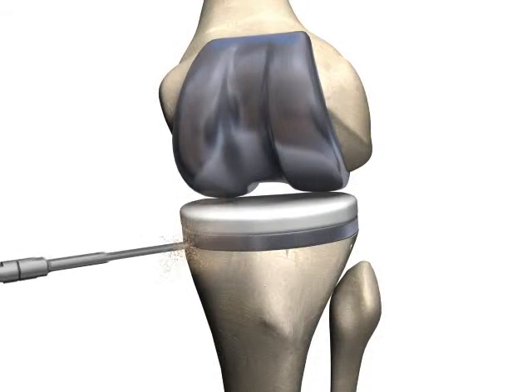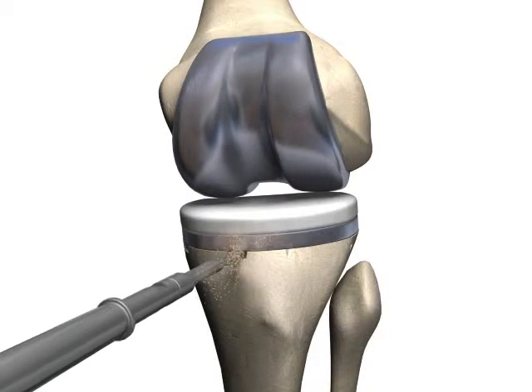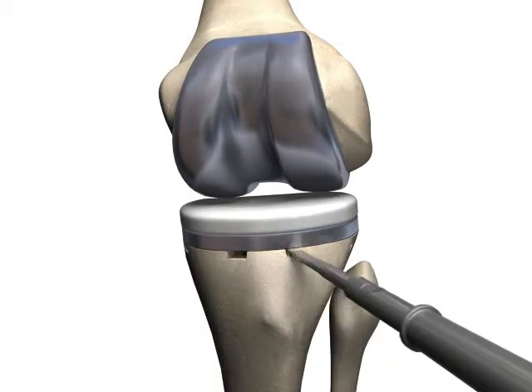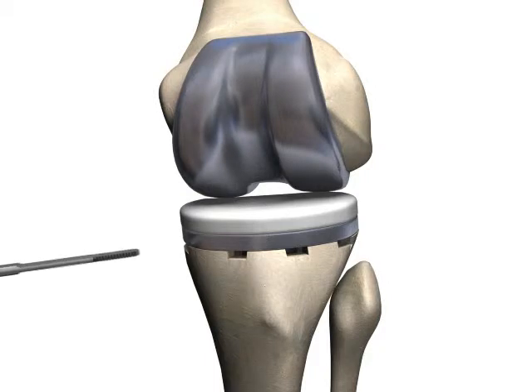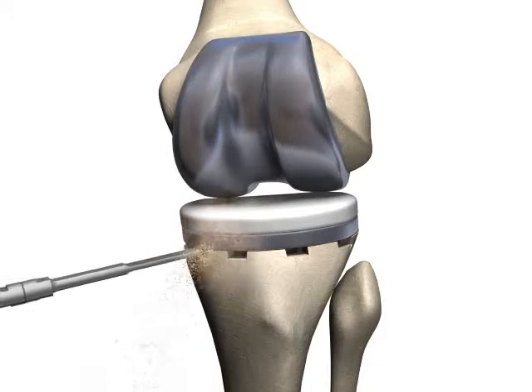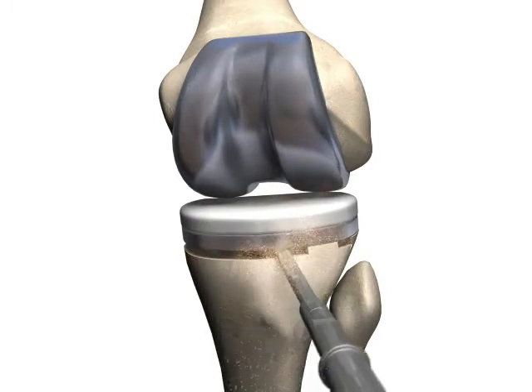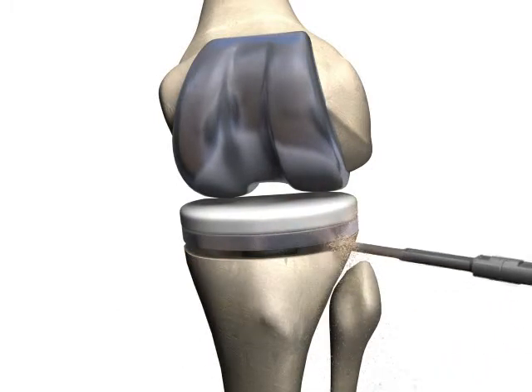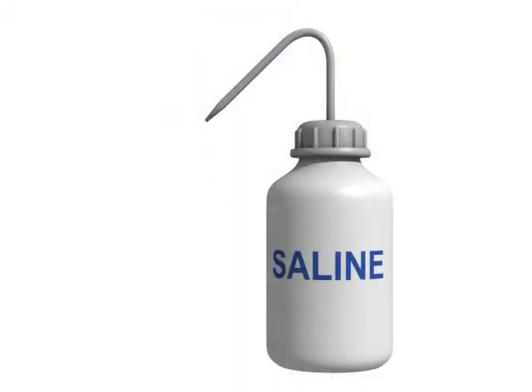The 6mm flat osteotome probe is used to penetrate the interface and create slots under the prosthesis. The 6mm serrated probe can then be used laterally to break the remaining bond between bone and prosthesis. A high-pitched noise will be heard when the active probe is in contact with the implant. It is important to not use heavy manual force while this noise is present, and to continually use irrigation while the probe is active.